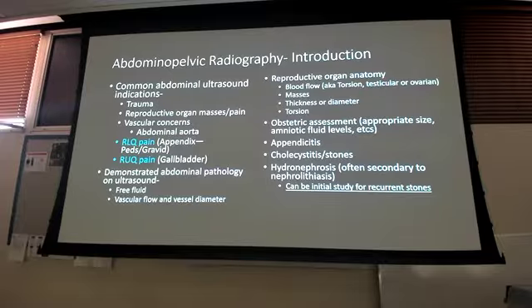That is testicles, ovary, uterus, anything that reproduces or has something to do with reproduction. With the exception of one thing, which we will talk about towards the end, it's the fallopian tubes. Ultrasound doesn't see those very well. We have a special study for that, and we'll talk about that later. But everything else that has to do with reproduction is ultrasound, okay?